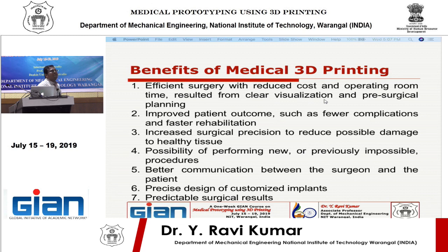Cost in the sense, nowadays if you are using FDM technology for planning the surgery, rehearsing the surgery, it may not cost much. But if you are printing a metal implant which is going to be implantable, it may cost you much, but the outcome is good, there won't be any complications, and the success rate of the surgery may be high.